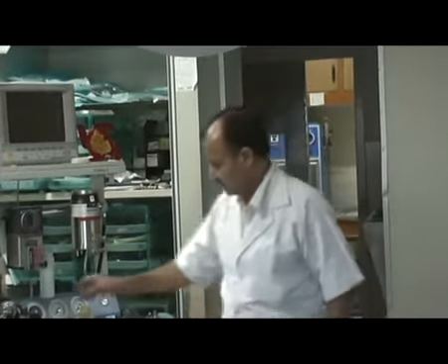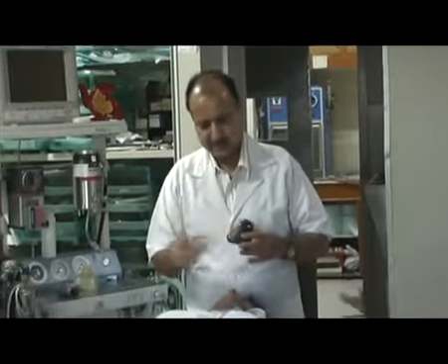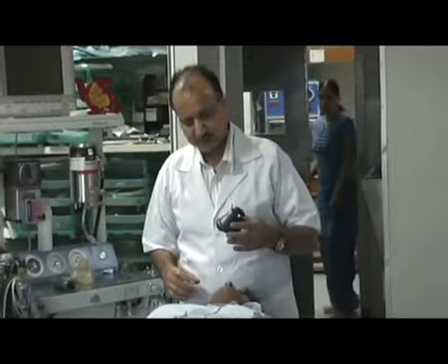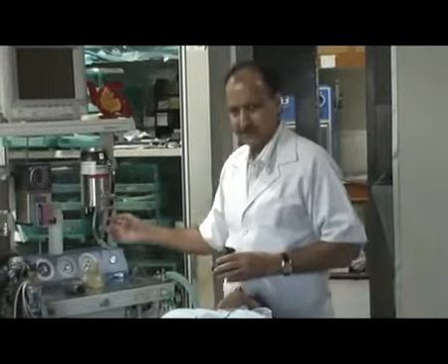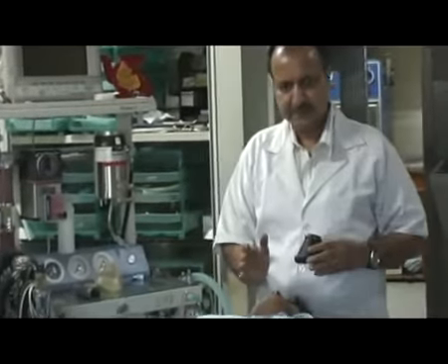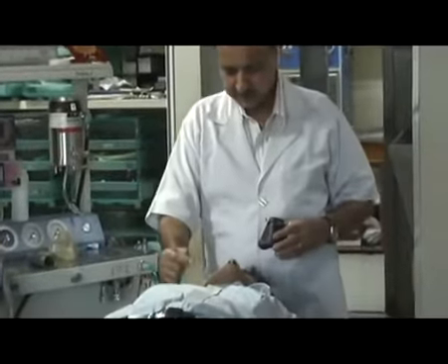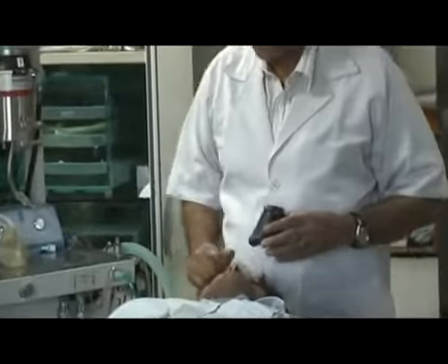Welcome to the world of anesthesia. Today I'm going to demonstrate the use of a face mask. This face mask is used to administer anesthetic gases from an apparatus to the patient without introduction of any instrument to the patient.